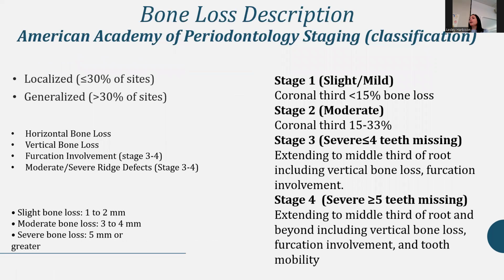Okay, so this slide is packed. McGee is going to deconstruct this for you next semester, probably in more detail, but this is everything in one big fell swoop, although there's no grading. When you stage periodontal disease, there's staging and grading, and I'm not even getting into grading because it's not really applicable for looking at bone loss on radiographs. It's just too much information, and you'll learn it next semester.